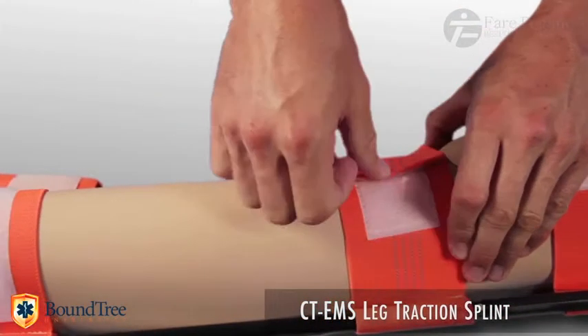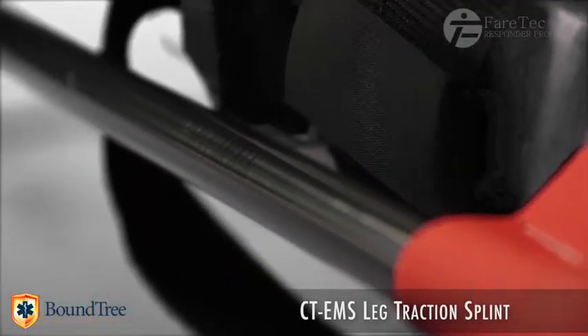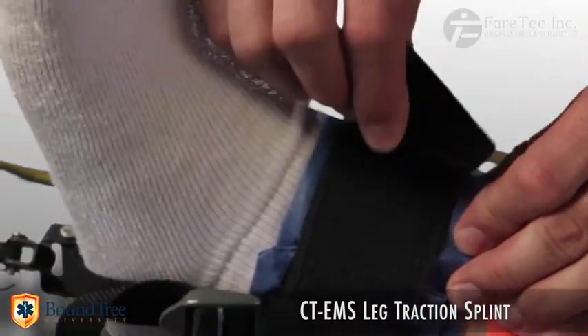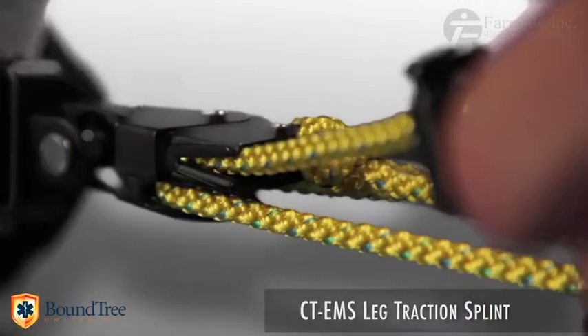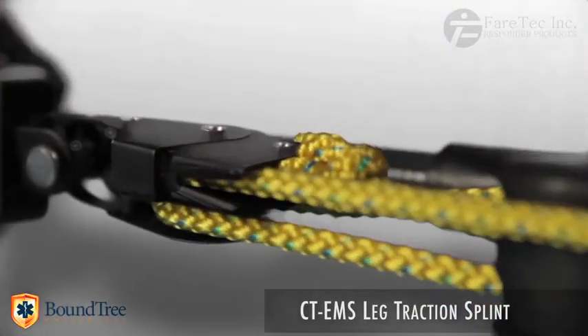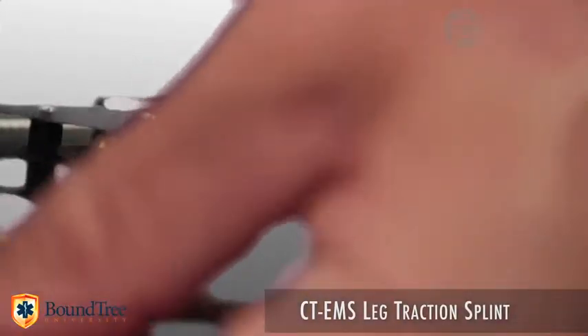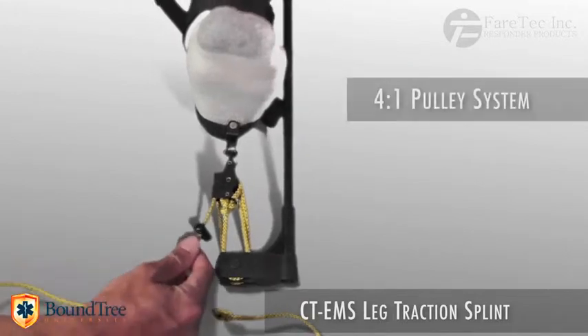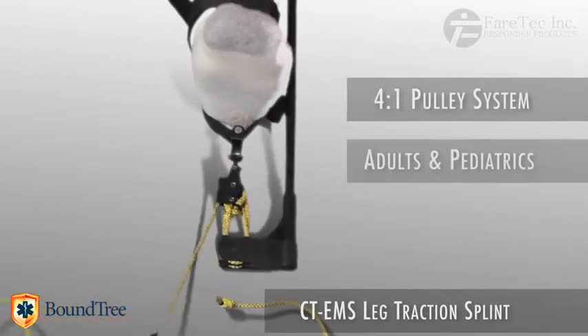Its materials consist of carbon fiber tubing, glass-filled nylon, and heavy-duty elastic strapping. The CT-EMS utilizes a 4-to-1 integrated pulley system that can be locked off at precise increments. This traction method allows for perfect adjustment on large patients that require many pounds of traction.